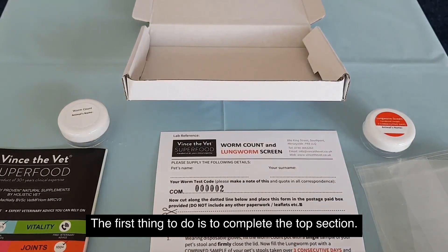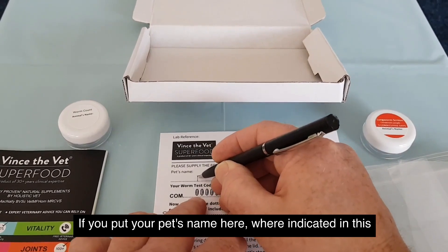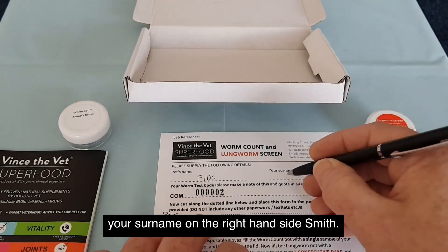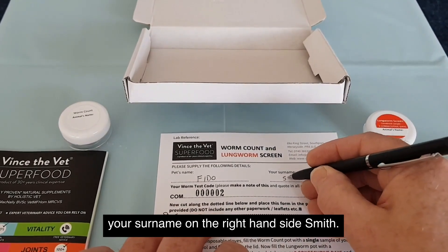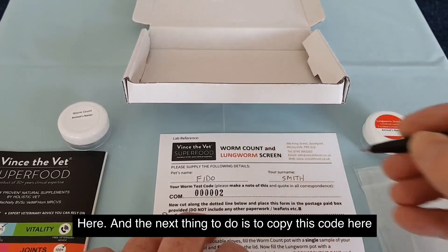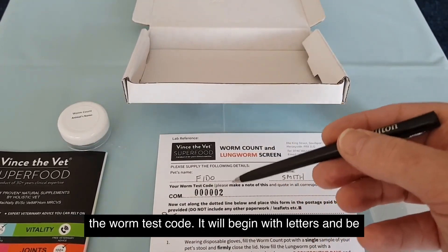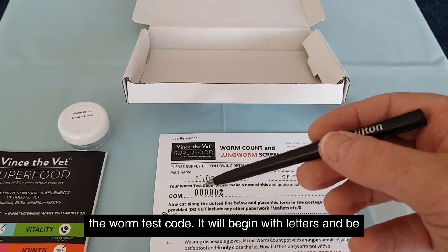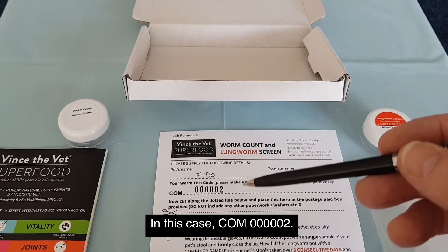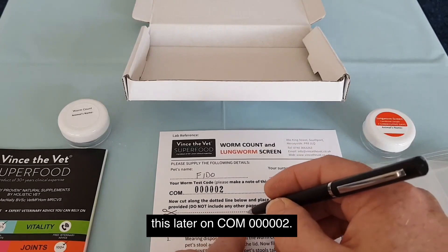The first thing to do is to complete the top section. Put your pet's name here where indicated — in this case, Fido. Put your surname on the right hand side — Smith. And the next thing to do is to copy the worm test code here. It will begin with letters followed by six digits — in this case, COM000002. Copy that below the dotted line because you will need this later on.